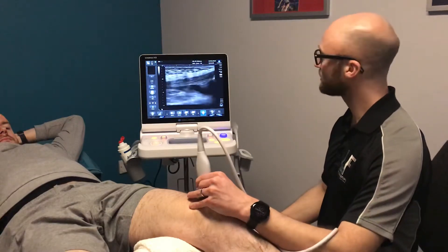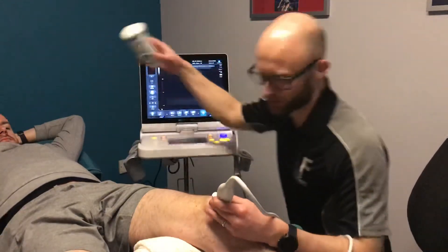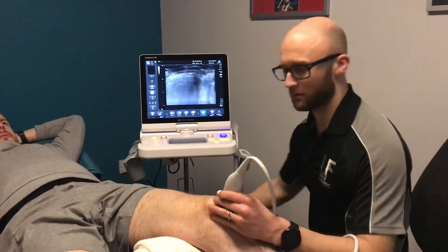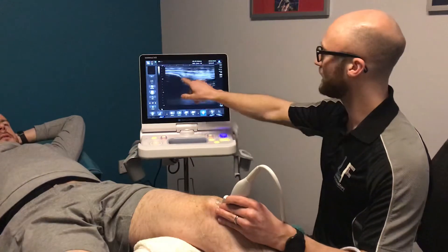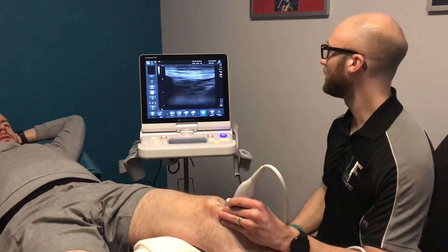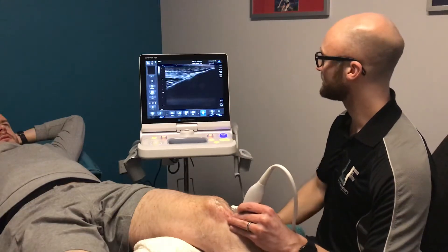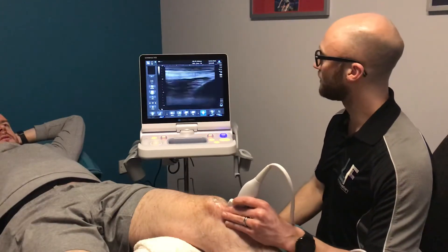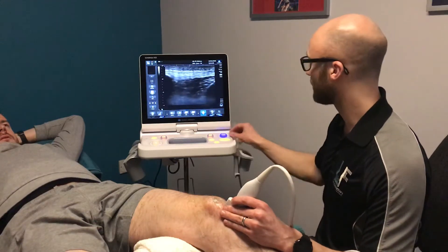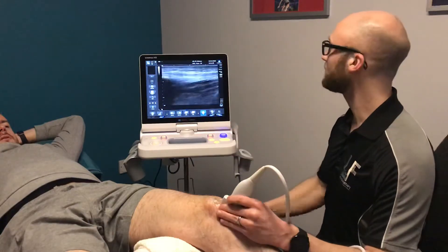We can have a look at the quadriceps tendon and follow that down. We just need a little bit more gel to get some contact there and we can follow that down to the patella tendon — the tendon that connects the patella, the kneecap, all the way down to the top of the shin bone called the tibia at the tibial tuberosity. We can pick up issues related to the tendon itself in this zone. I'll just bring my depth down a little bit for a better image.